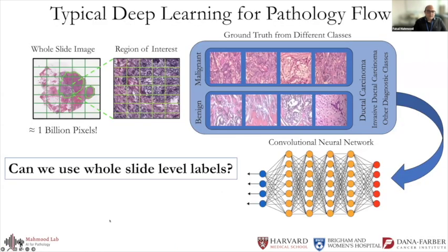So just to take a step back and reiterate some of what I already said in a more descriptive manner. So this is a whole slide. It's very large. It can be 1 billion pixels. It's typically analyzed using a microscope. It's just a glass slide analyzed under a microscope. Now it's been digitized and it's very large.